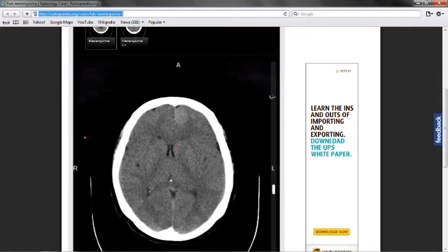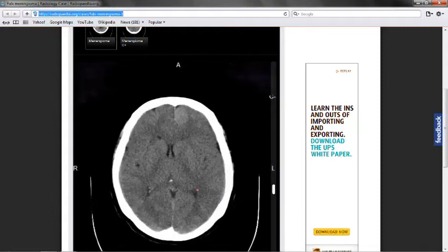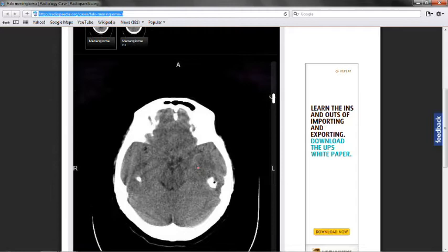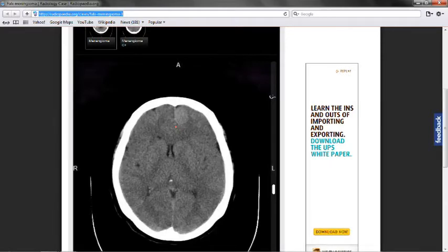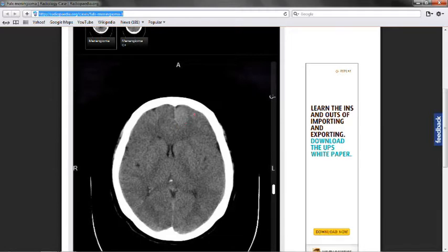Interestingly enough, we do have a midline shift. It looks like here would be the midline, and our ventricles are slightly pushed over. Kind of unsure what is causing that. But look along the midline and see if you see something coming in. Chances are it's very hard to distinguish, but here it is.